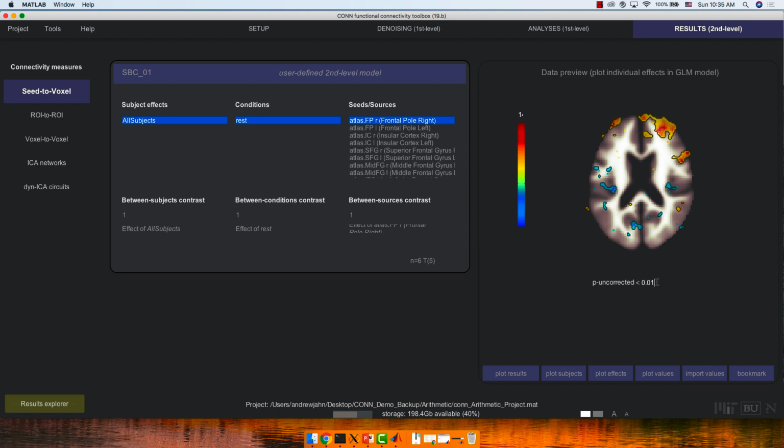I mean, it's not going to be terribly interesting, but mostly just to make sure that the second level results are in the ROI that you think it should be. We talked about plotting. You can plot subjects if you want to. This is kind of a biased ROI analysis, only for descriptive purposes, just to check it out.